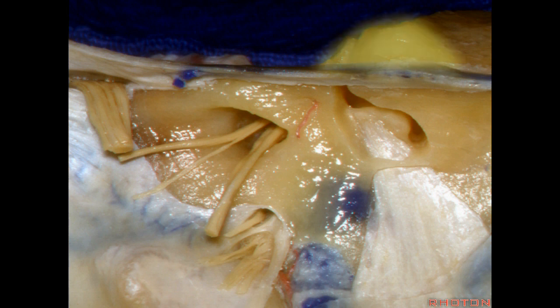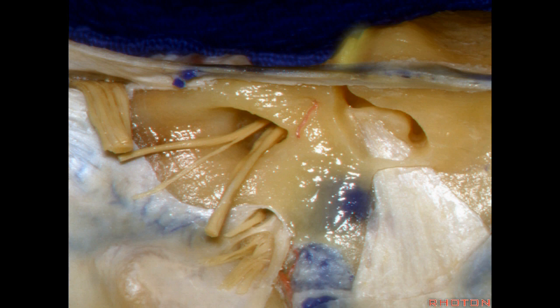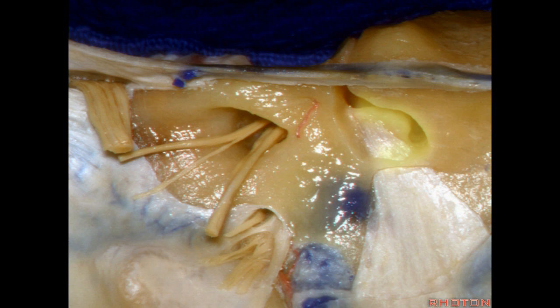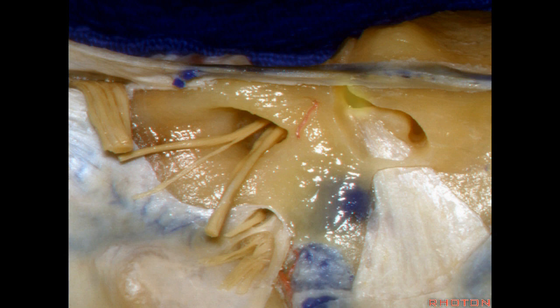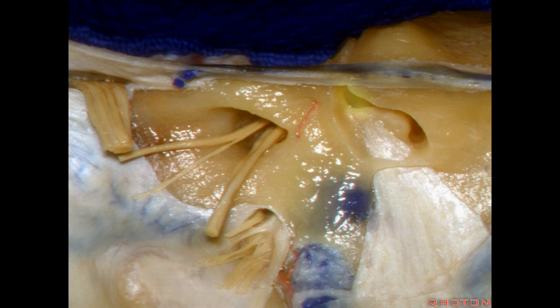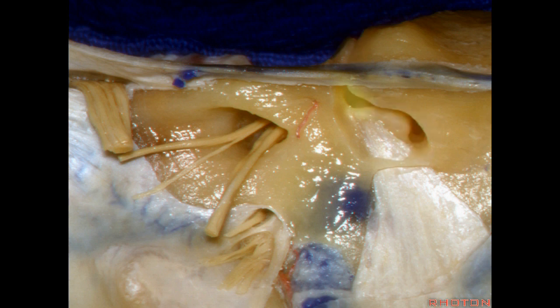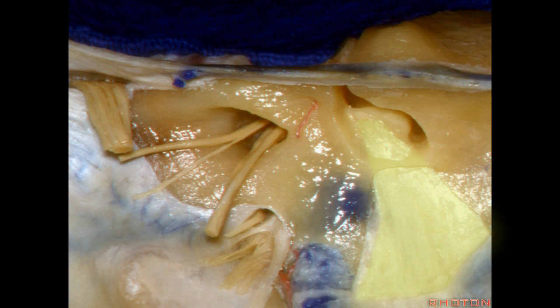What is this prominence? Arcuate. And what canal is that? Superior. And this is the canal of the posterior fossa — the posterior canal — and the canal of the middle fossa. What did I drill into here? Common crus — the junction of the back end of the superior canal and the up end of the posterior canal. And you can drill into it — the common crus — or you can get into the endolymphatic sac.